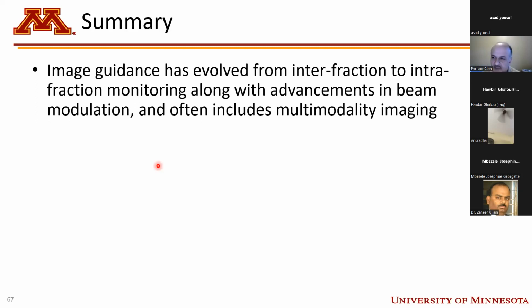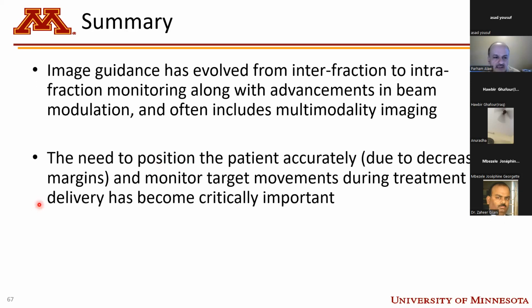I mentioned X-ray based only here, but oftentimes you have surface imaging plus infrared markers potentially and X-ray imaging combined, multimodality imaging. Positioning the patient accurately, due to decreased margins, and monitoring target movements has become critically important. The previous speaker alluded to that: the bladder filling, the rectal filling, all of them differ every day. We use smaller margins these days with VMAT and IMRT, so it's very important to monitor that.